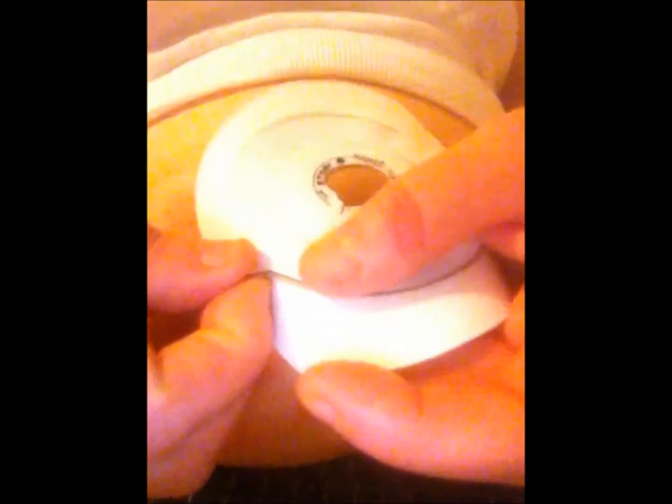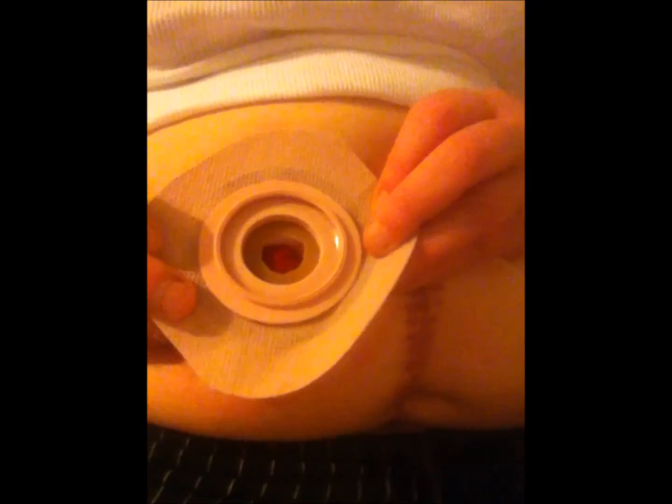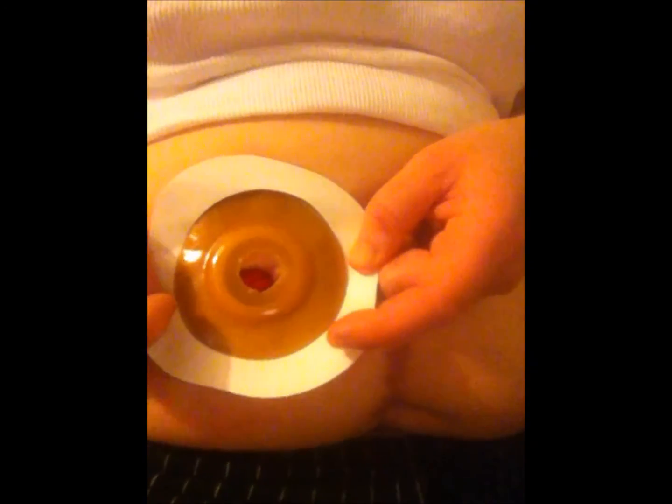Okay, and then I take off the paper, and this does expose it to be the correct size. As you can see, it will fit. Well, I don't want to touch it on my ostomy, but it does fit right on top of there.